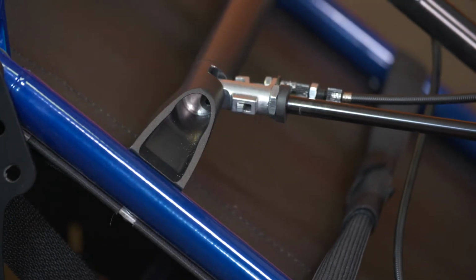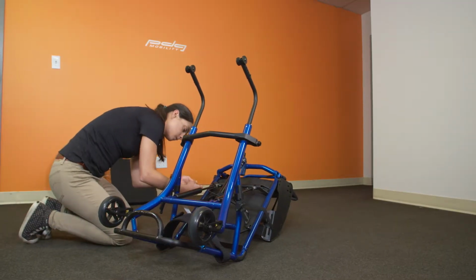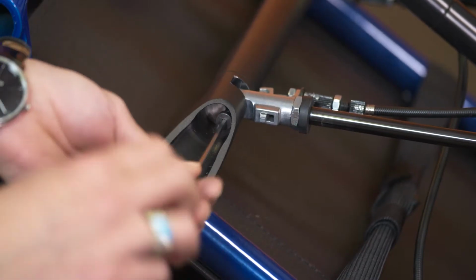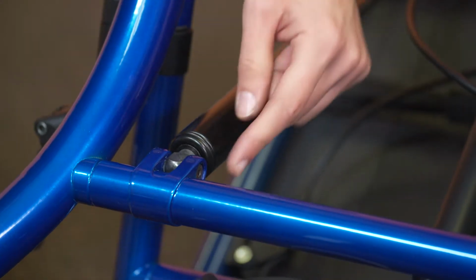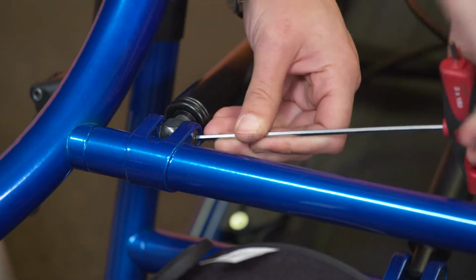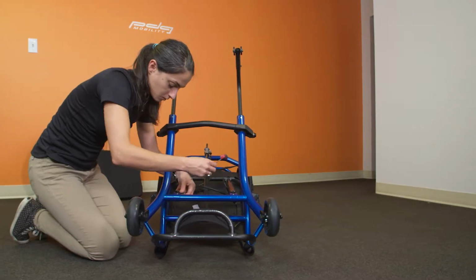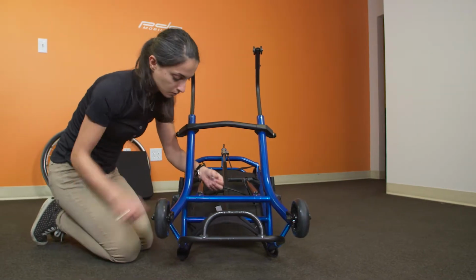Begin by removing the fastener at the rearward end of the strut. The fastener is mounted through the rear upper frame crossbar. Next, remove the fastener at the forward end of the strut at the lower frame. Now you can remove the gas strut from the chair and detach the cable.